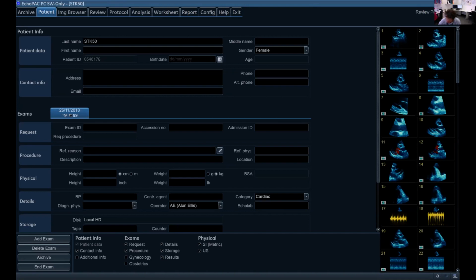So, which stage of the cardiac cycle does right atrial collapse happen in? During systole. Yeah, and particularly early or late? Early. Yeah, very nice, exactly. And so the right ventricle? Diastolic collapse. Very nice. And early or late?